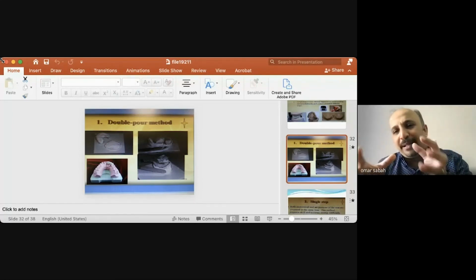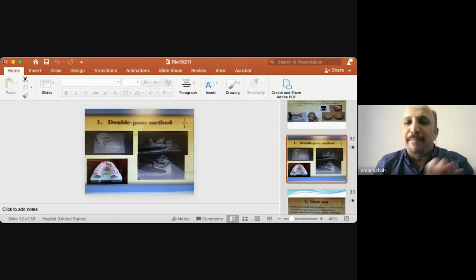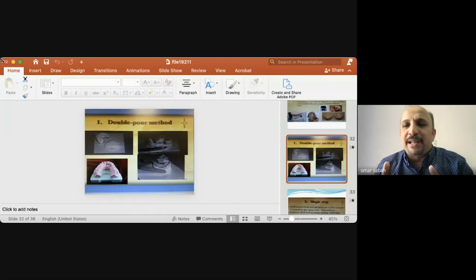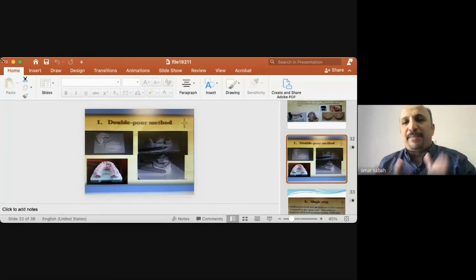بينما انا اذا اخذتوها بماتيريال ثقيله شويه، يعني قويه شويه، خلينا نقول امبريشن كومباوند اللي شفته ممكن اسجل هاي العلامه وارجع على السبيشال تراي تجيني كلش تقريبا فت على هاي الرج، يعني حوالي 2 مليم او 1.5 مليم الثكنس. اوكي، بعدها ايش اطيق اعمل؟ اطيق اضيف الماتيريال مالي، لانه الماتيريال هي تتطلب مني انه 2 مليم. بعد هاي ال 2 مليم صارت عندي، لانه بالسبيشال تري راح اضمن انه كل الاناتوميكال لاند ماركس صارت التري مالتي تقريبا شبه البيس مال دينشر.